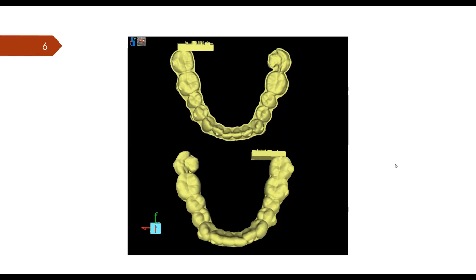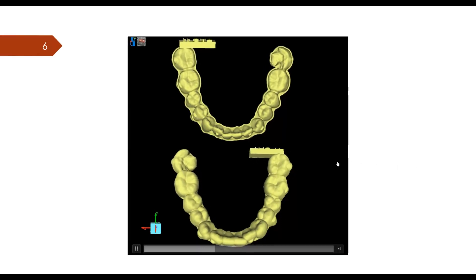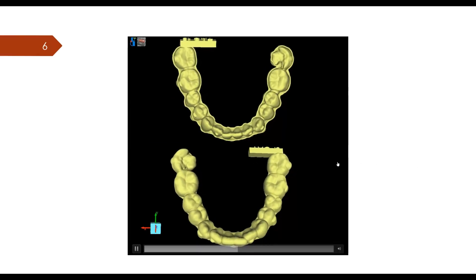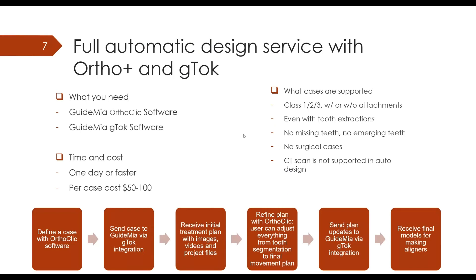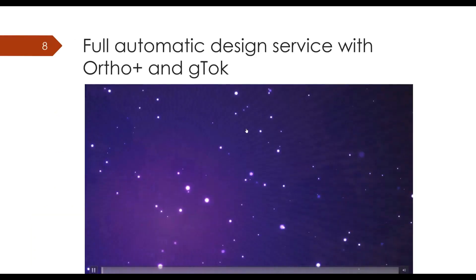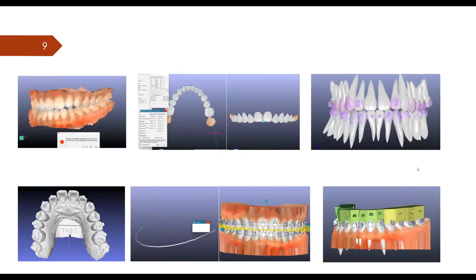We can also design aligner models. This video clip shows how we can review the aligner models in the software, going through one step at a time to review all the aligner designs for direct printing purposes. We also generate arch models for aligner manufacturers for thermoforming. We'll skip the demo video for now since we're about to do a live demo.